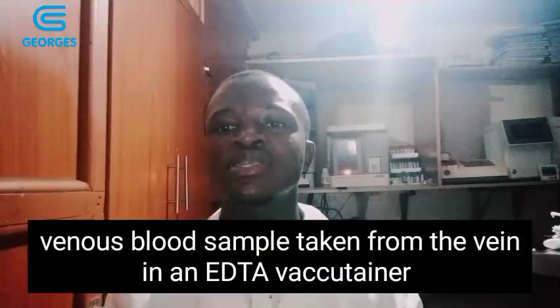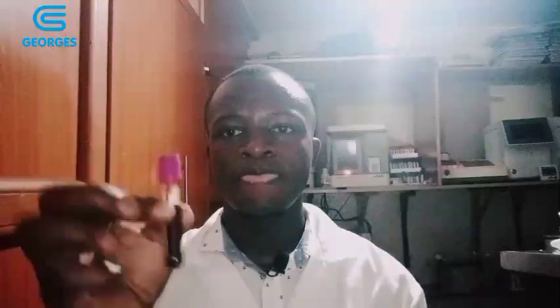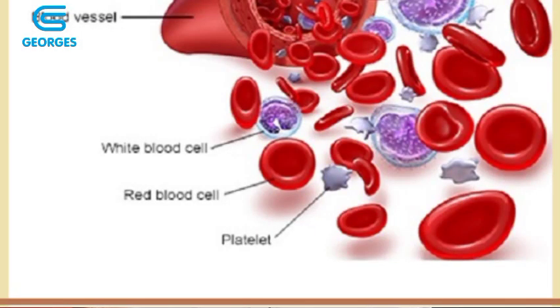Peripheral whole blood is obtained from the veins, and the test is done within 6 to 8 hours, and the test is also done at room temperature. We use a purple top tube to obtain the sample for the full hemogram. Here, as you can see, we have to know that your blood is composed of very many elements. We have the red blood cells, the white blood cells, and the platelets. All these are cellular components that come together to make up your blood.